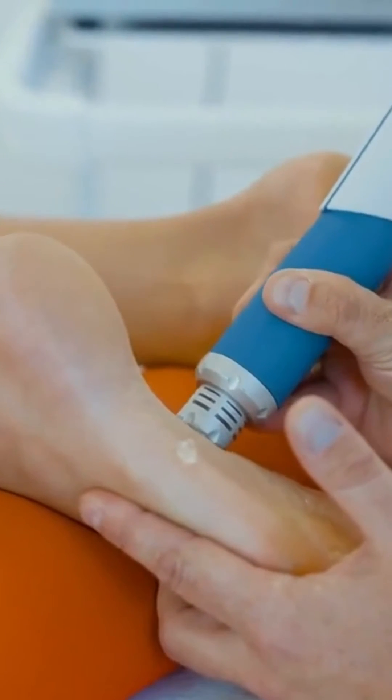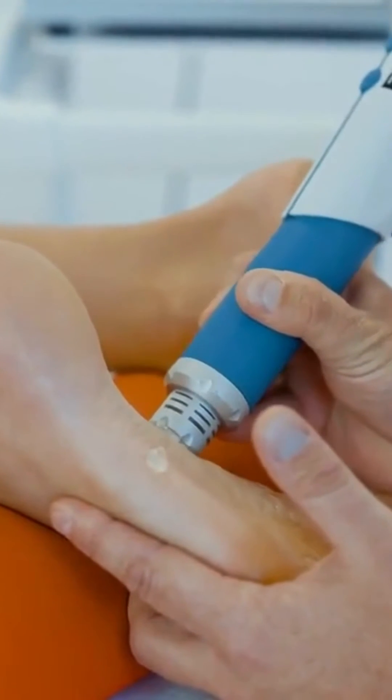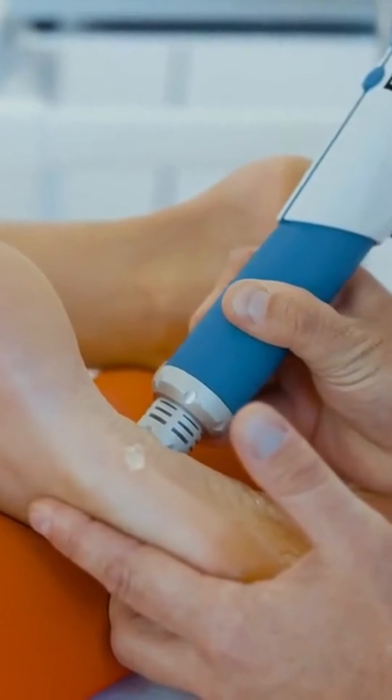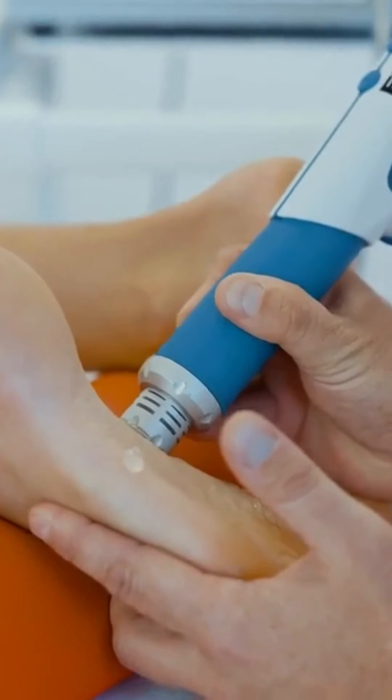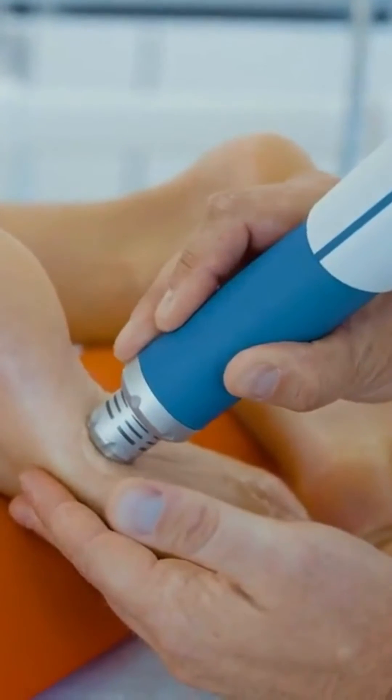Application on the foot can be done with different applicators, depending on whether the application targets a large or a small surface. This video shows an application with the 15 millimeter tip. The treatment can be applied on a single spot.